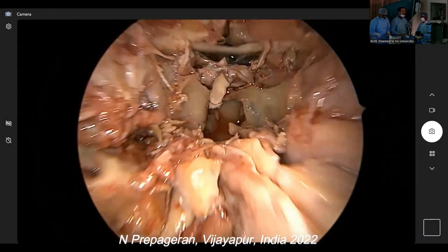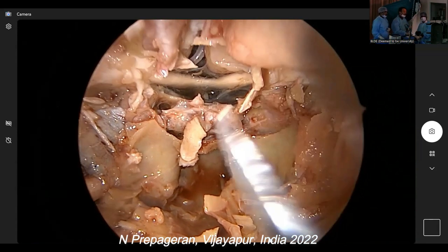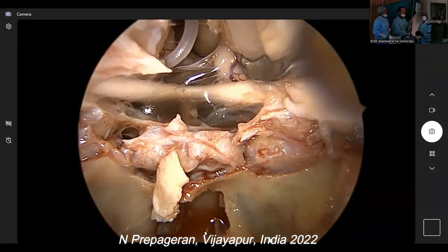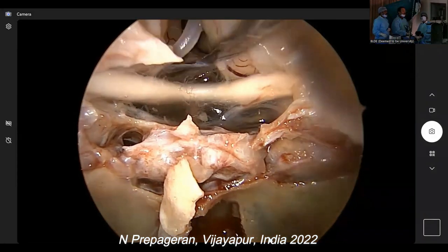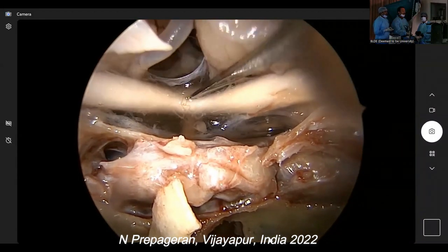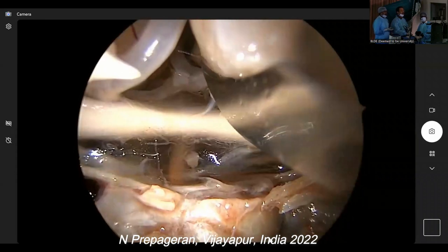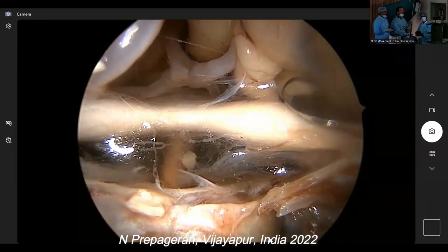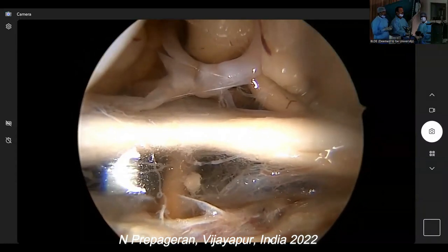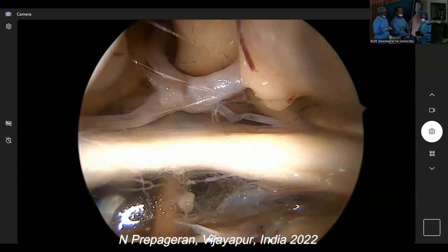Okay, sickle knife. So now you can see we are able to look at the ACA. You see, guys? ACA. Wow, beautiful. Anterior communicating artery. There. Right ACA, left ACA, anterior communicating artery. Very nice. And this is the artery of Heubner. Beautifully seen. Can you see, guys? Right ACA, left ACA, artery of Heubner.